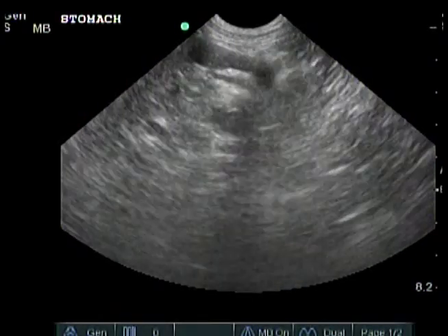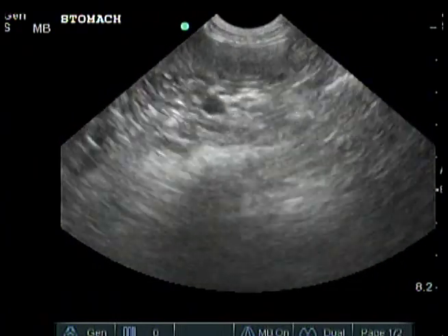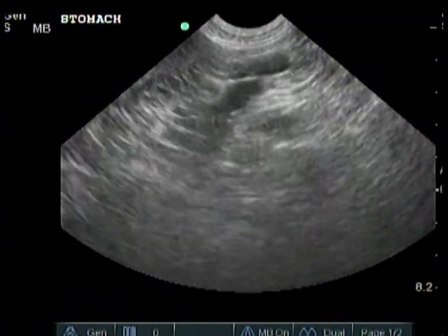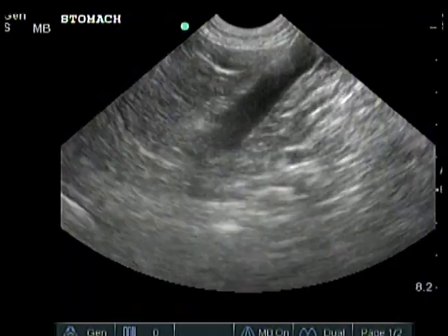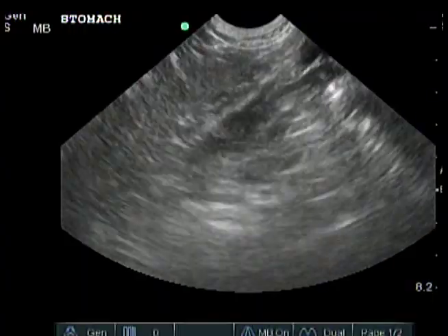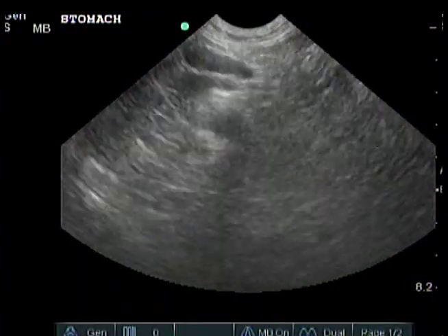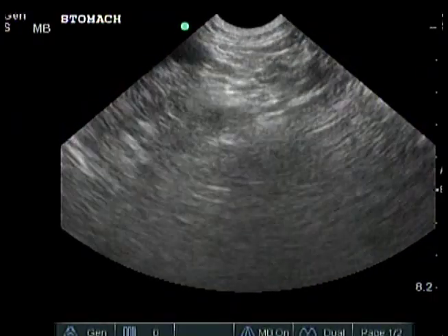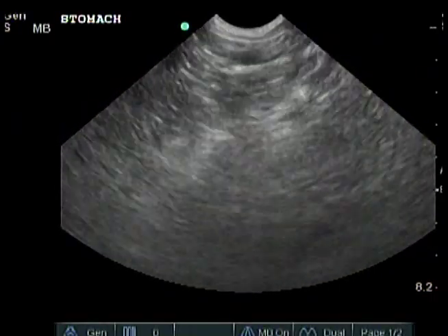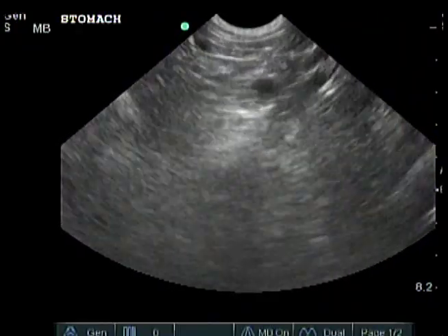An intestinal torsion interferes with blood supply to the intestines and can cause vomiting, rapid deterioration, and death of the patient. Consider intestinal torsion when enlarged blood vessels are found but cannot be clearly associated with a major abdominal organ, such as a spleen. Blood vessels may or may not show color with color flow Doppler.